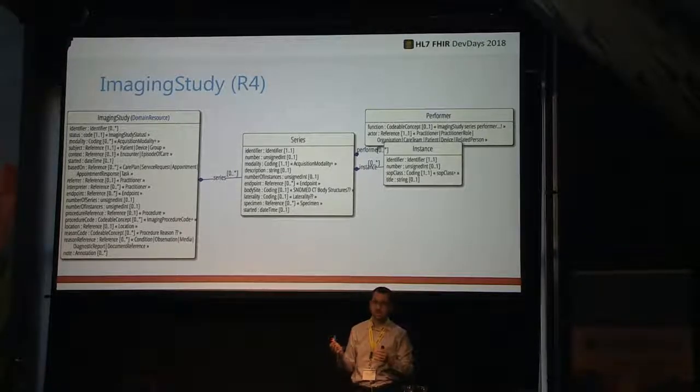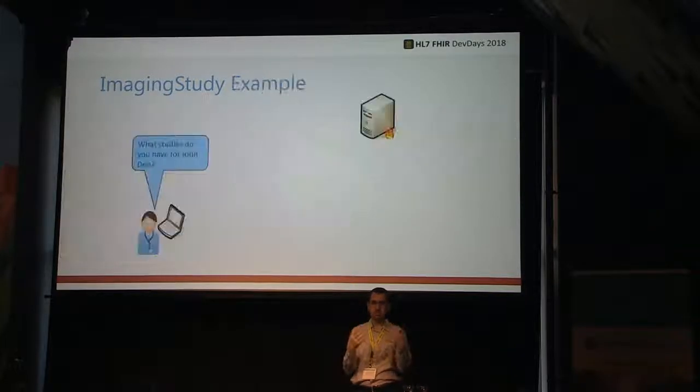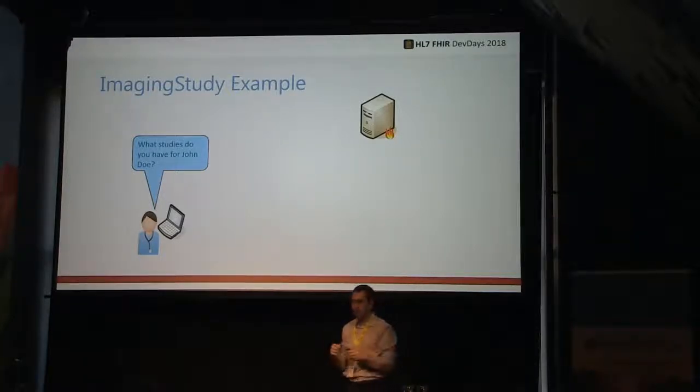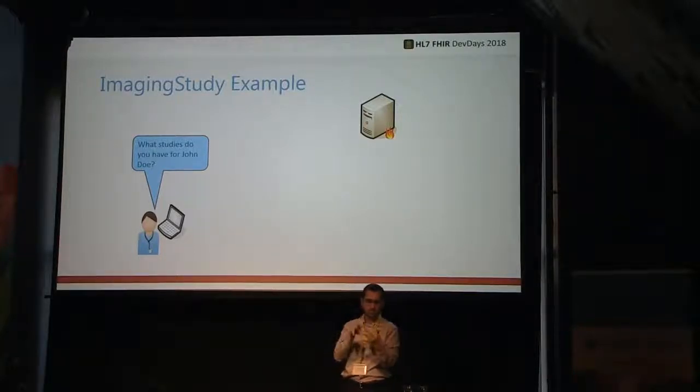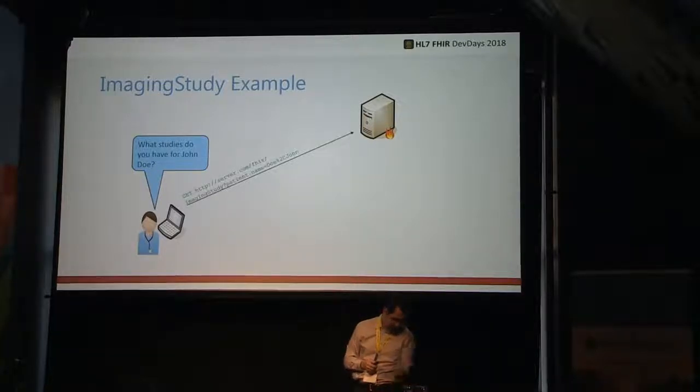Another one is GSPS, and I'm not going to bother you with what it stands for because it doesn't mean much, but basically GSPS is a way of adjusting the image so it displays the most optimally. So things like brightness, contrast, zoom, etc. Even measurements, you could actually leave annotations. And another fact some people may or may not know about DICOM is the measurements are never burnt into the image. They're never stored in pixels. They're always stored as vectors. The two are separate.